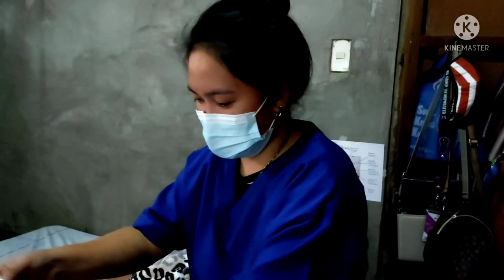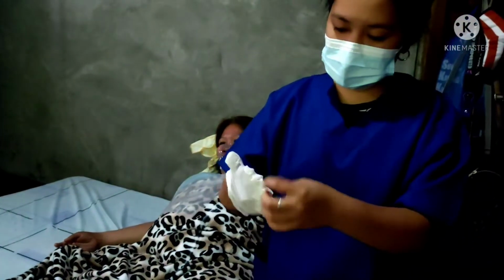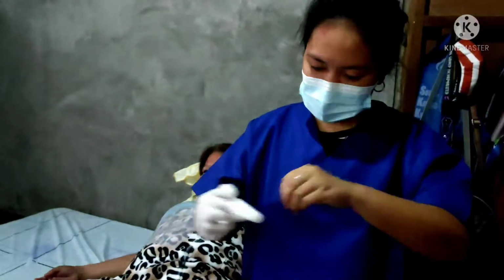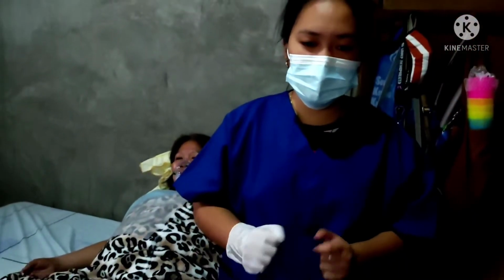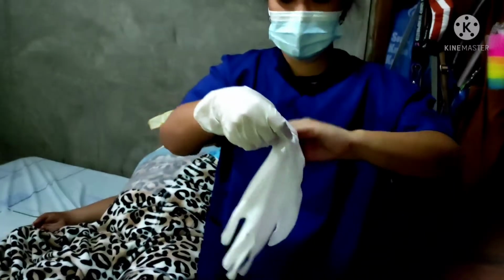Be careful not to touch the package, depending on your agency's policy. You'll now apply either a pair of sterile gloves or a sterile glove on your dominant hand. So this is our dominant hand. Clean gloves on your non-dominant hand. So this is our non-dominant hand.